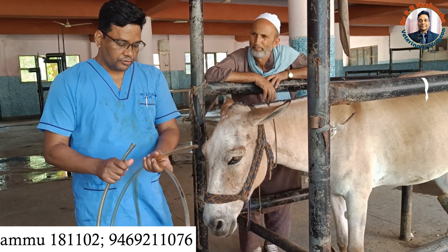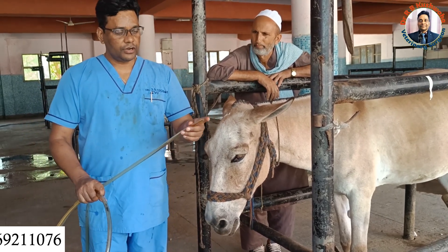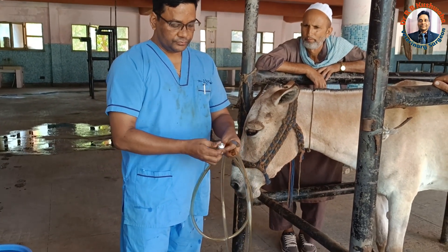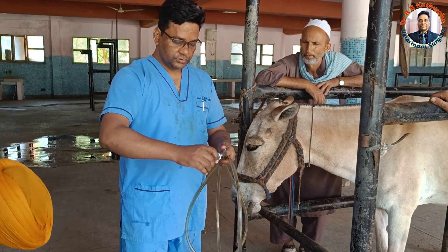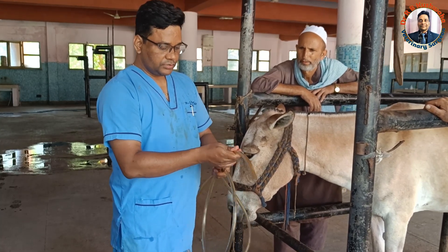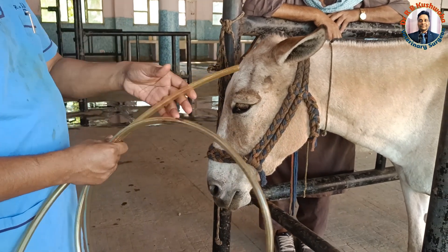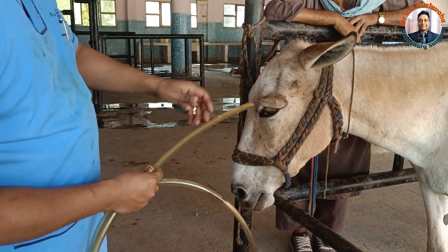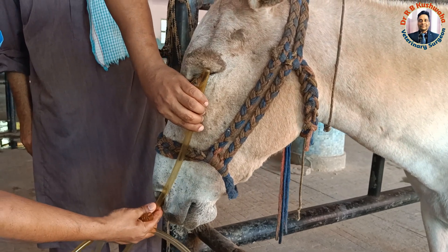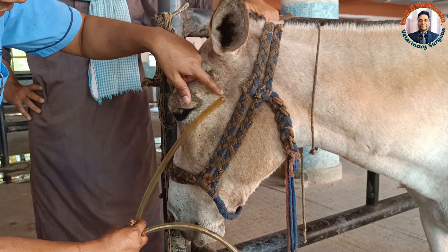For passing this naso-gastric tube, first we apply lignocaine jelly or any lubricant at the tip of the tube. Then we measure the approximate length of the tube — from the lateral canthus of the eye to the nostril. If the tube has gone inside up to that portion, it means it has reached up to the pharynx.